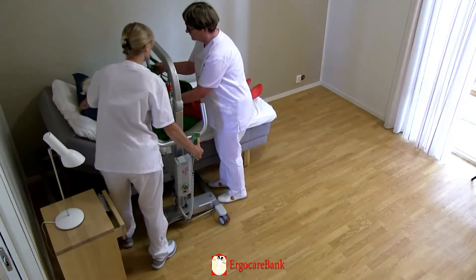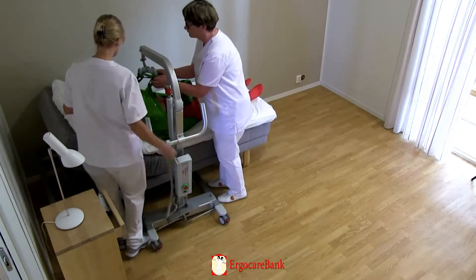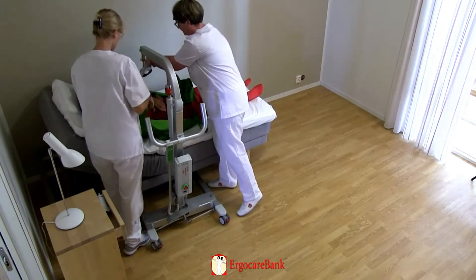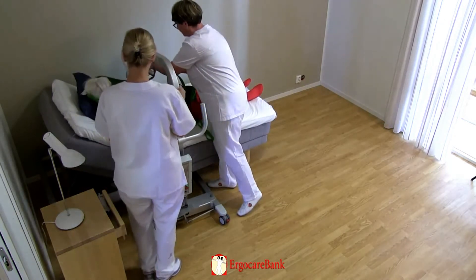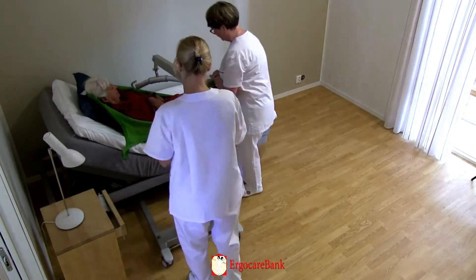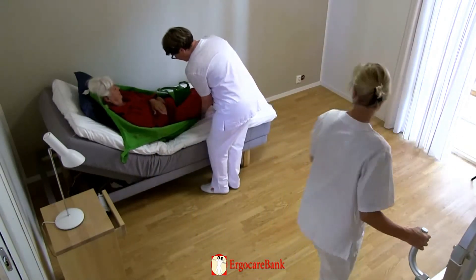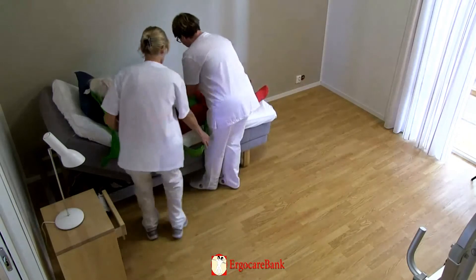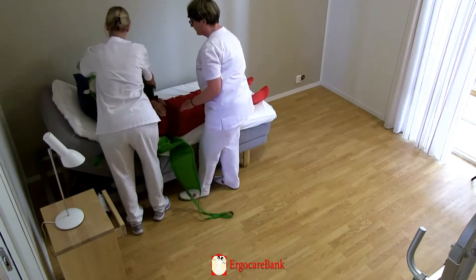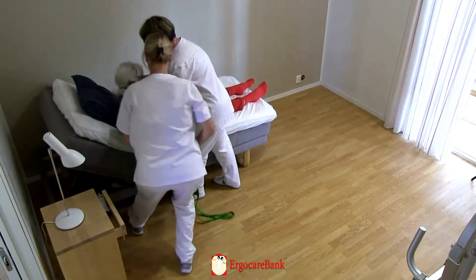The staff detach the sling from the hoist and move the hoist out of the way. The sling is then removed.